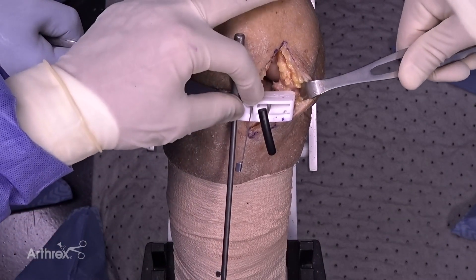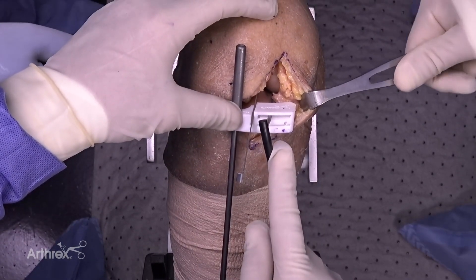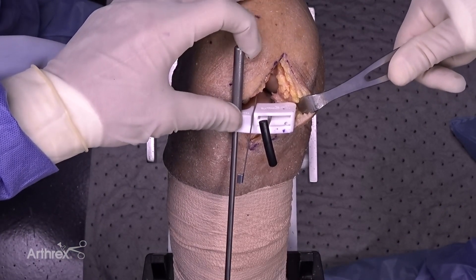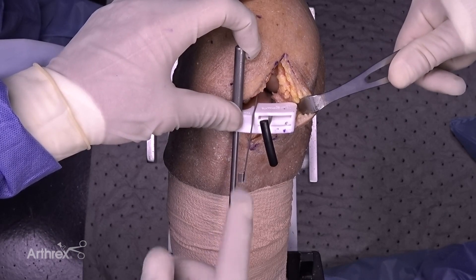At this point, depth of resection and slope has been determined by my pin, varus-valgus has been determined by my drop rod, and rotation and medial-lateral position by my ruler. Everything's set.